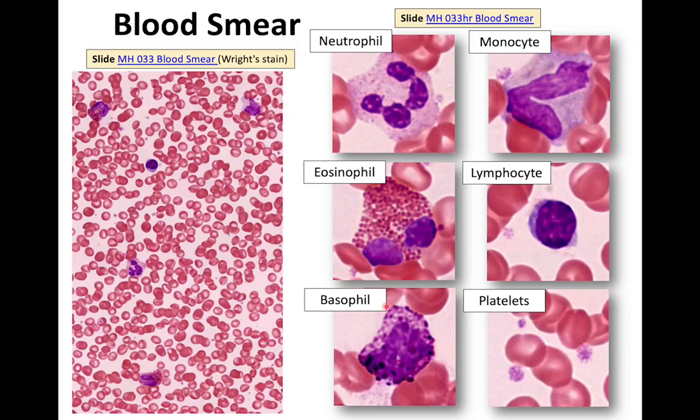The third type of granulocytes are basophils. As their name indicates, the secondary granules are basophilic. They appear blue. And like eosinophils, the nucleus is bilobed. Basophils are the rarest white blood cells. They are very rare, less than 1%. So if you have a hard time finding them in a blood smear, you can use the legend.